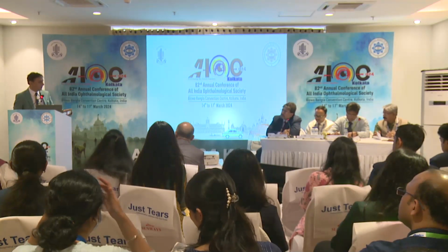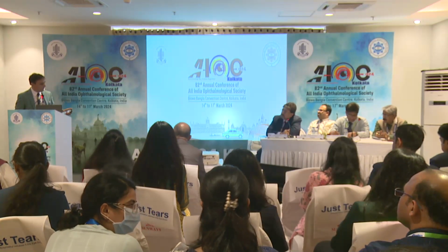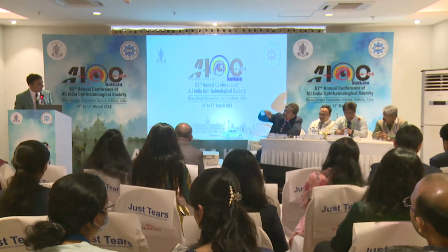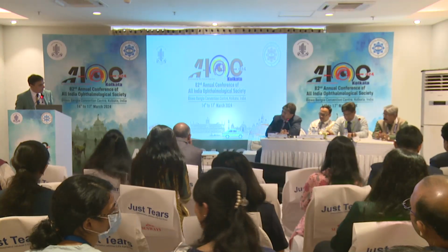So of course after that you need capsular hooks, etc. And the capsular hooks are held on well with a femto CCC. So it's as strong, it doesn't give way or give up. So that's one thing. It also takes care of the tilt because the depth is at different levels for focusing, because there's a built-in OCT, so it takes care of that.